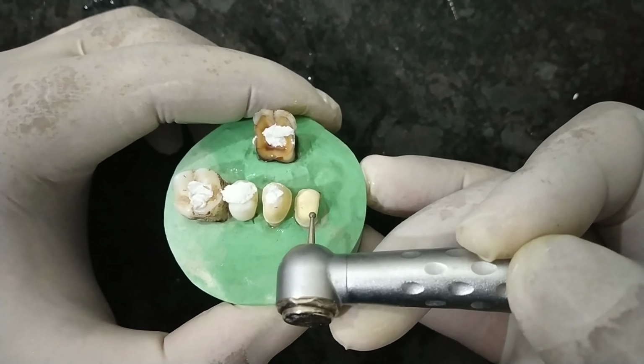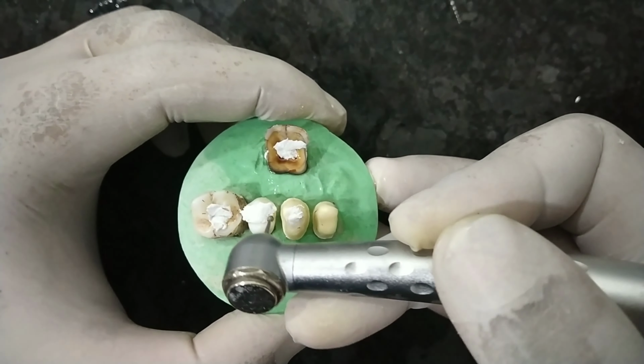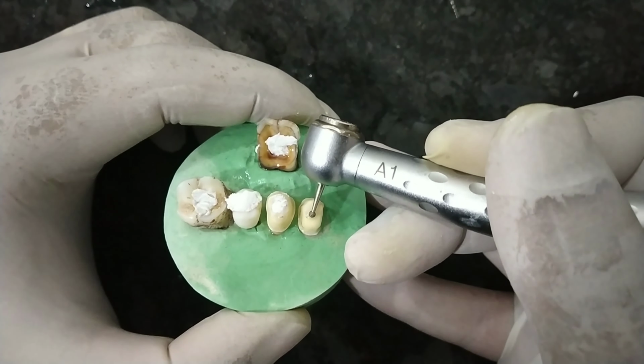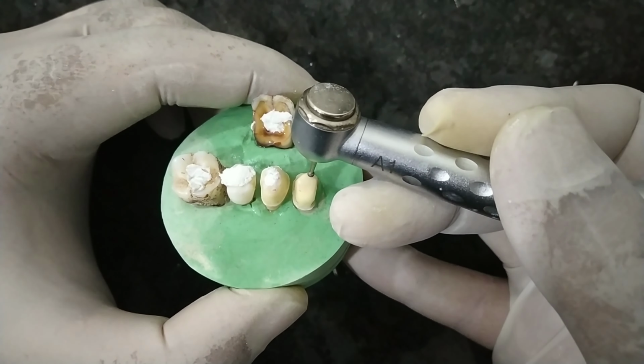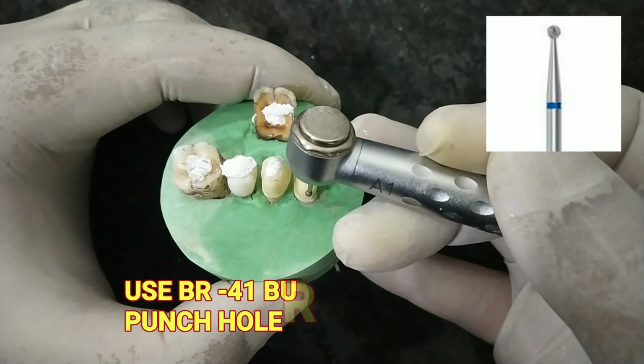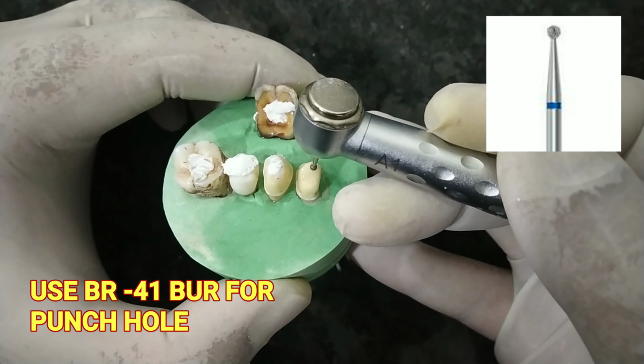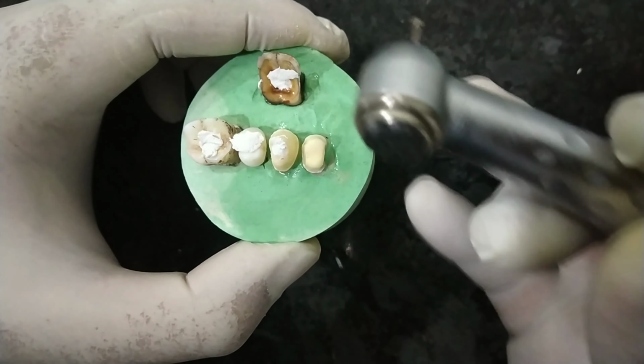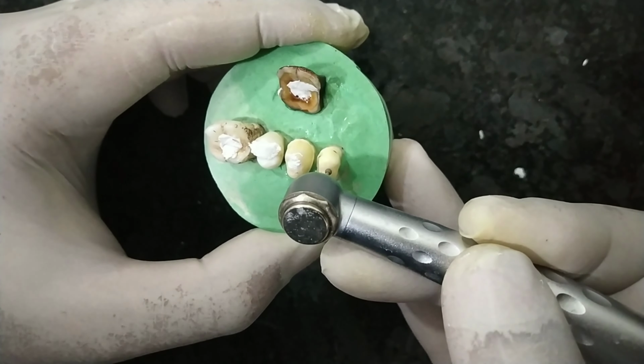So now I am doing the opening of the premolar tooth. As you can see, I have mounted many teeth and I have filled them with temporary filling so that it's easy to understand. So the premolar tooth has a buccal cusp and a palatal cusp, and the pulp horns are present directly below the buccal cusp and the palatal cusp. So how you have to make the access opening is you just have to make a punch hole.